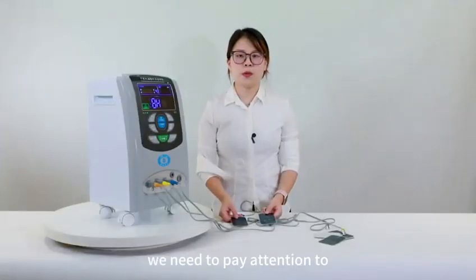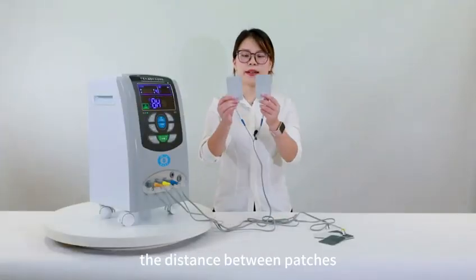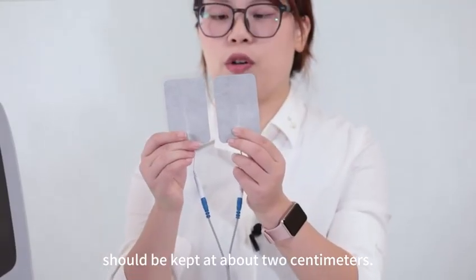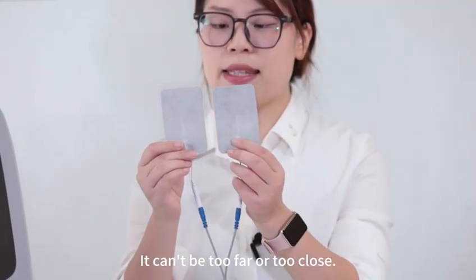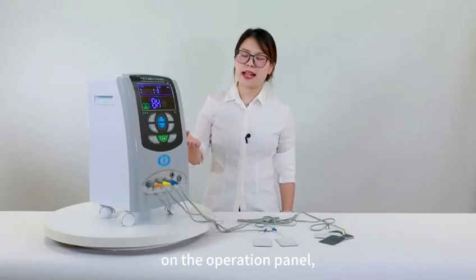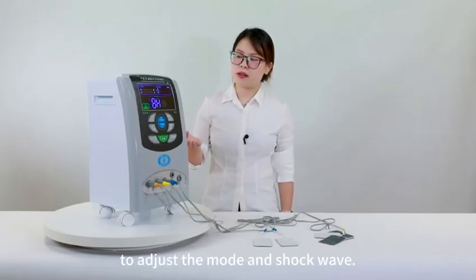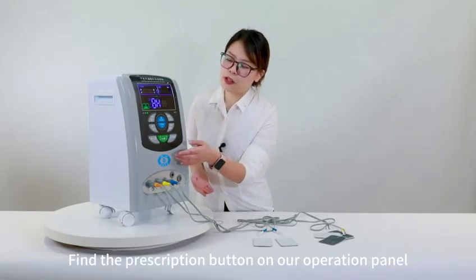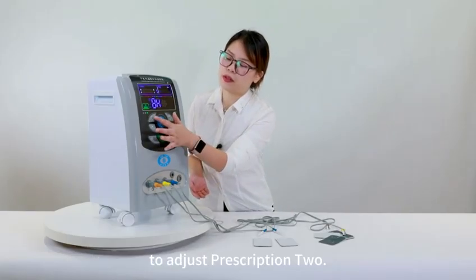Here, we need to pay attention to the distance between the patches. It should be kept at about 2 centimeters. It can't be too far or too close. Next, on the operation panel, we adjust the mode and the shock wave. First, let's adjust the mode. Find the prescription button on our operation panel to adjust.